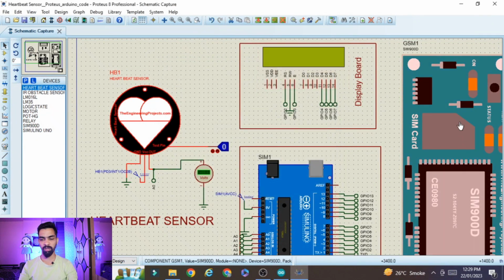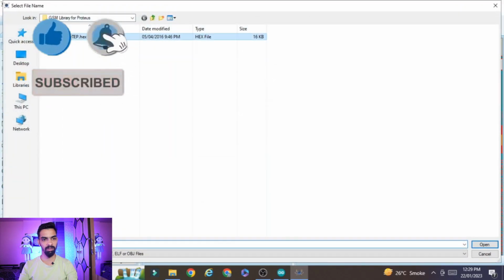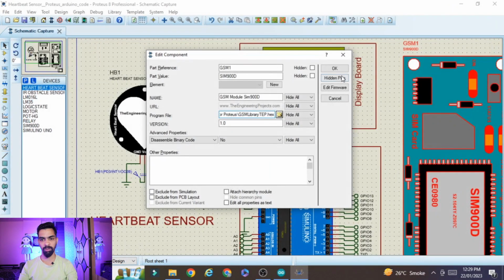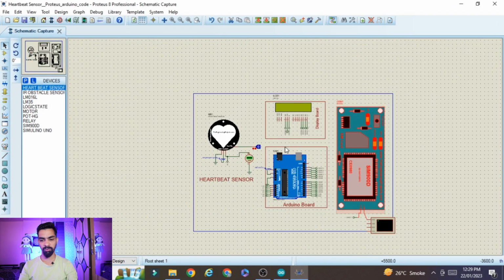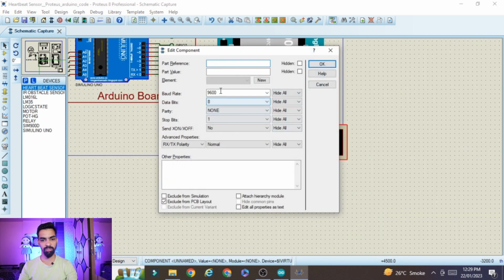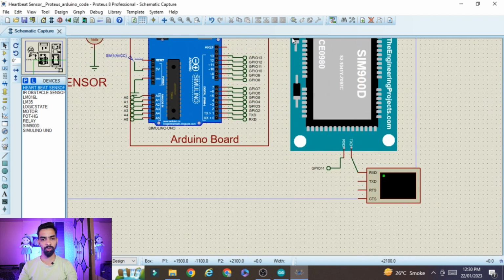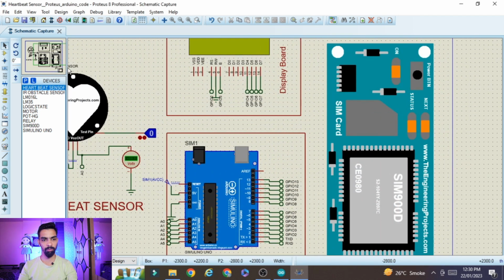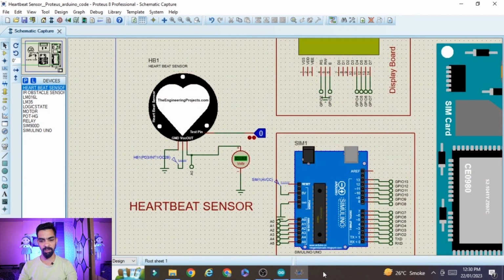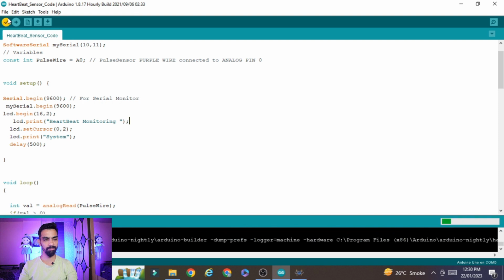Then double click on this GSM module, load the GSM hex file, click on OK, click on OK. Then first check the baud rate of this serial terminal. Double click here, the baud rate should be 9600. Then we need to load the hex file of the Arduino program in our project. So how to load the hex file? Go to the Arduino program and click on this Verify button.